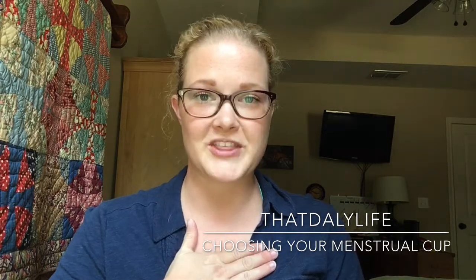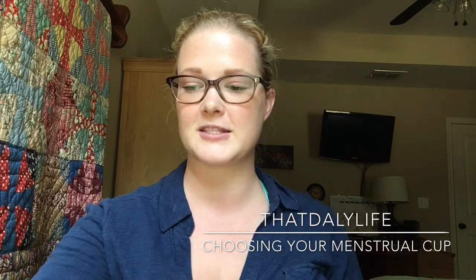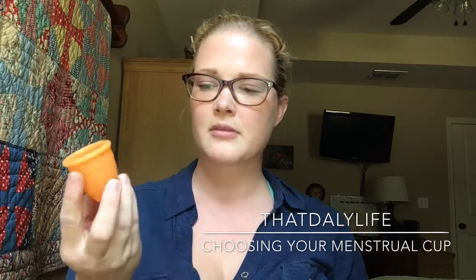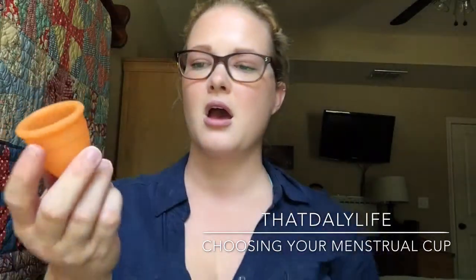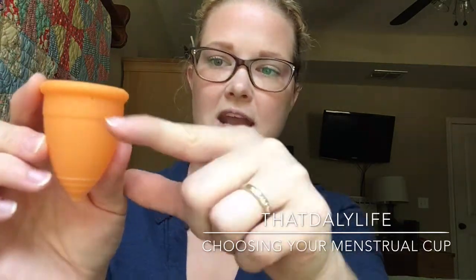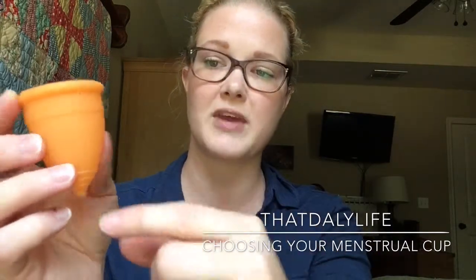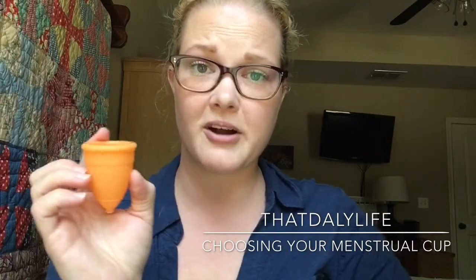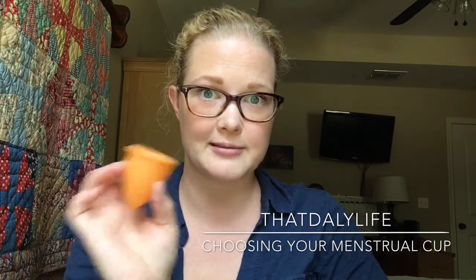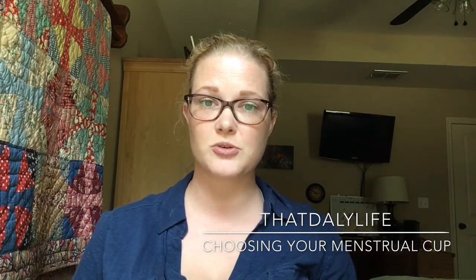And then, of course, like I said, I was originally thinking about capacity reasons. The reason the capacity really doesn't matter is because this holds, what is it? I think it's 20 mil. And there's some measuring lines right here on the side for you. Even wearing it 12 hours straight, I don't think I have gotten it past here. And here's a little hole, the air hole that'll help it to release whenever you're removing it. And 12 hours and only that much. With tampons, I was going through a super maxi tampon once an hour.